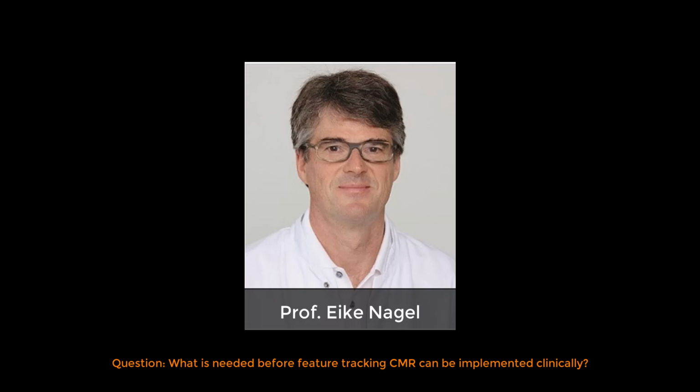In general, the issue there is that most of the cutoff values used clinically to determine, for example, whether a patient needs an ICD or not, are based on echo ejection fraction, and MR really needs to fight its way in there. And the more we have tools which are robust, easy to reproduce and fast, the higher our likelihood is to find ourselves a place in clinical routine for those questions. So I think we should just push to move forward and potentially start tackling echocardiography as the core technique for the first-line analysis of these kinds of patients.